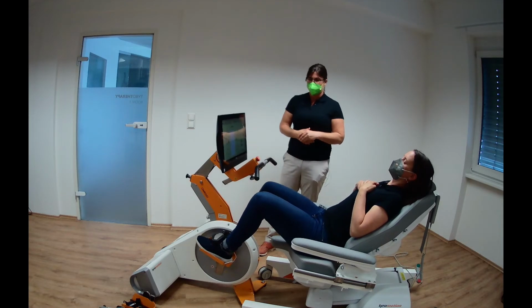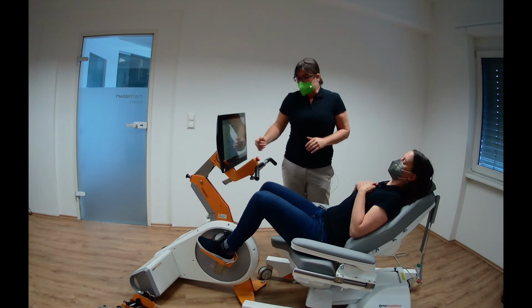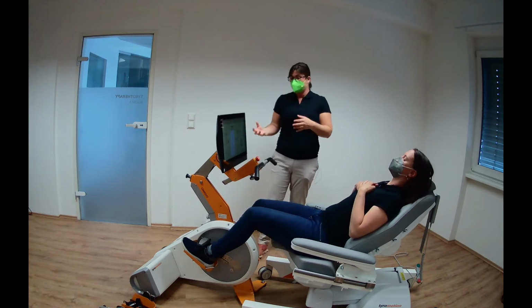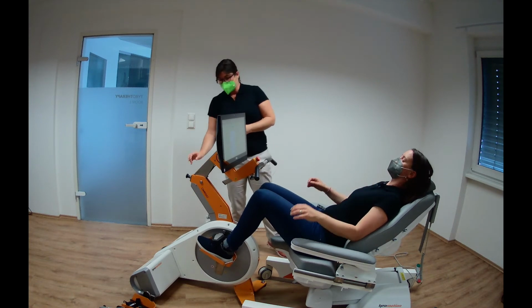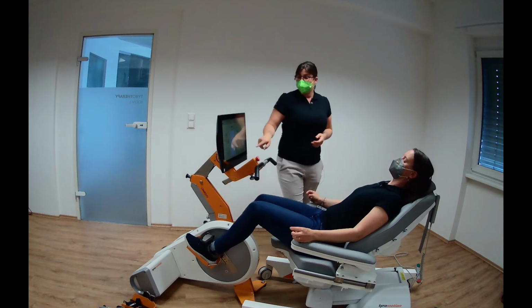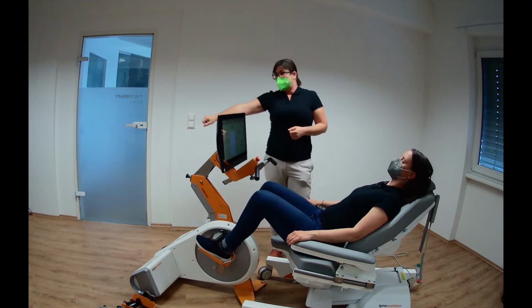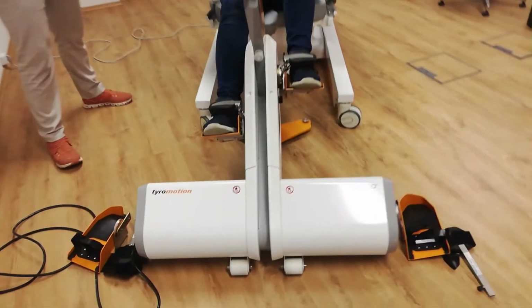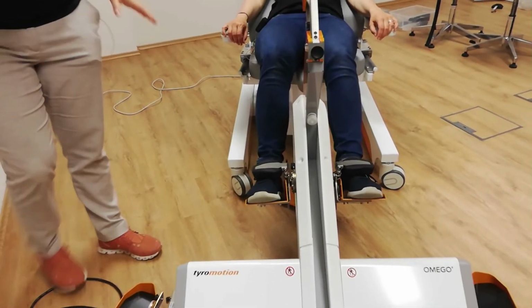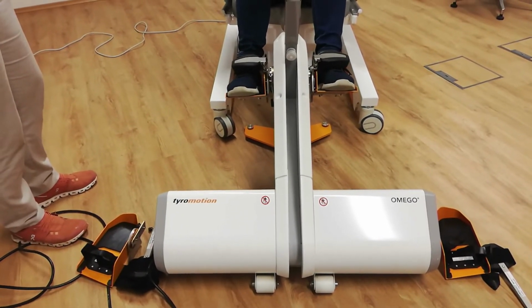All right, another thing I want to show you is the decoupling mode, because Omego comes with two drives, one on the left side and one on the right side. And we can use this pretty cool with the decoupled mode. Dominic will show you in detail now how this looks from the front, because the exercise is the same as before. I ask Barbara to press her legs down and up.